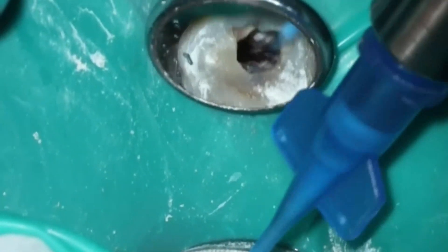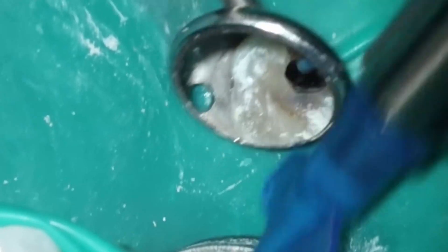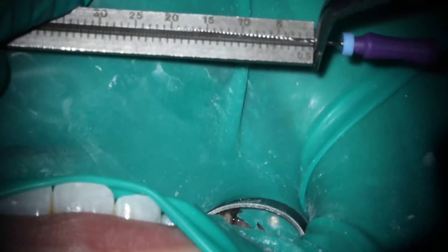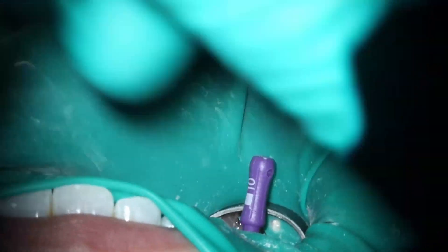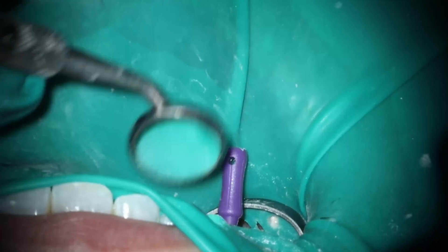The rubber dam was a little unhappy — it was sealed, but there was a hole, probably from the flat disk. It's not in the visible field, and this isn't for Instagram. Now we're doing working length, and I found last time I was droning on about working length, so I sped it up to three times. I have 100 videos showing how to do working length, so you all know how to do this. You can see testing all of these, making sure the lengths all look good, and they're all right around that 21 millimeter mark.